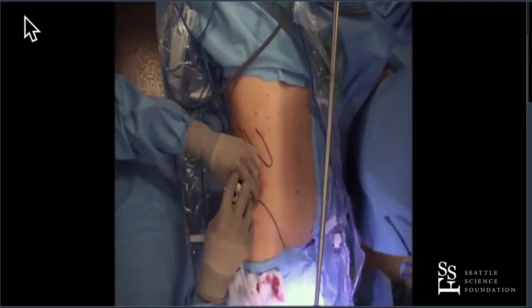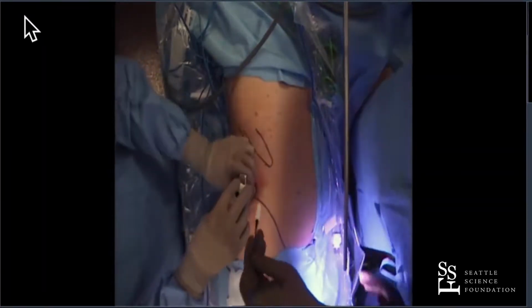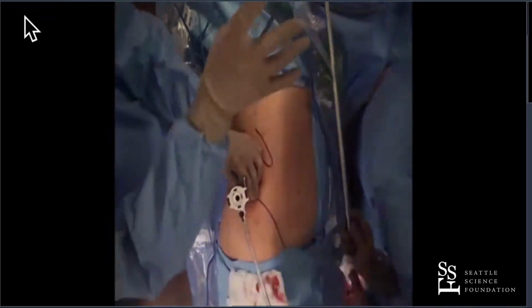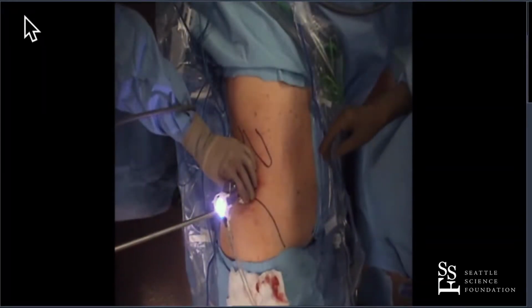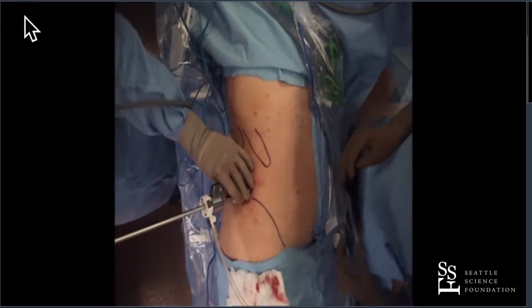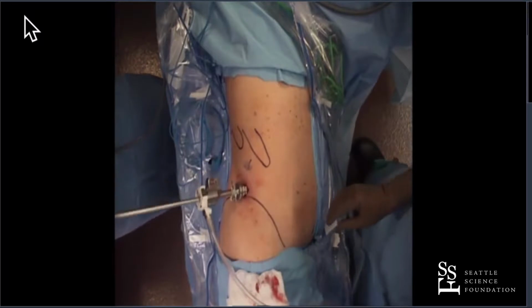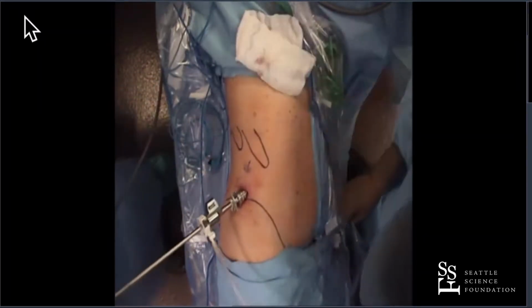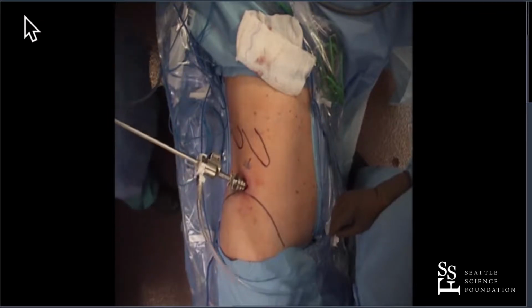Okay. So we're going to put the CO2 in here through this port first. And again, 30-degree lens. And here we are without a balloon. So you can see the psoas is now back up in our face. And there's Gerota's fascia right there. Want to go back inside? Let's go back inside.